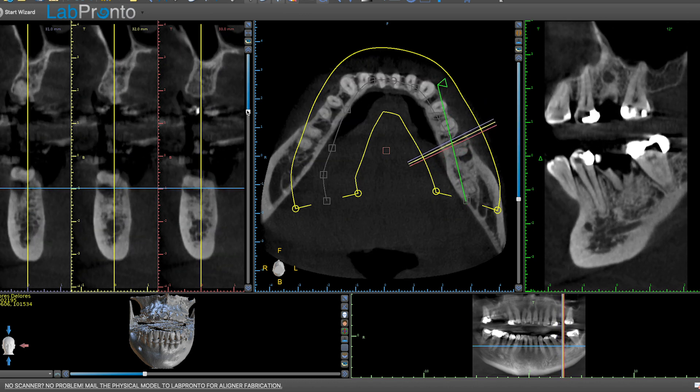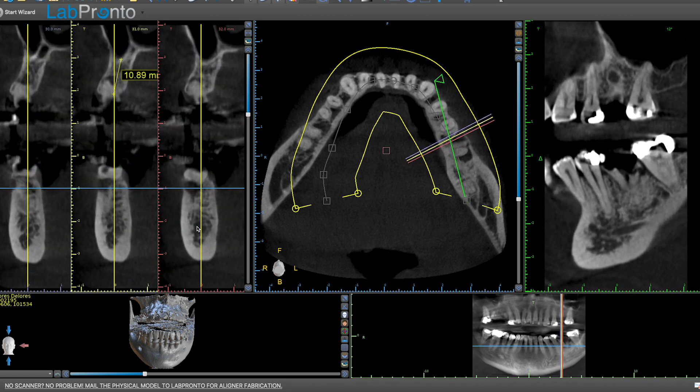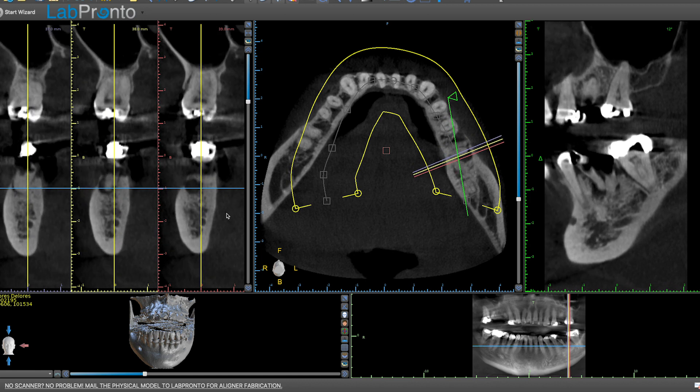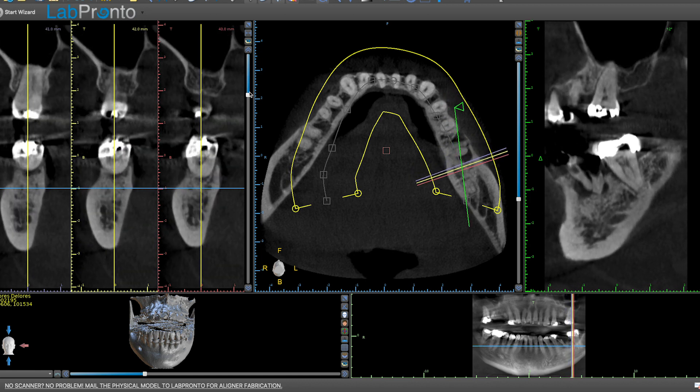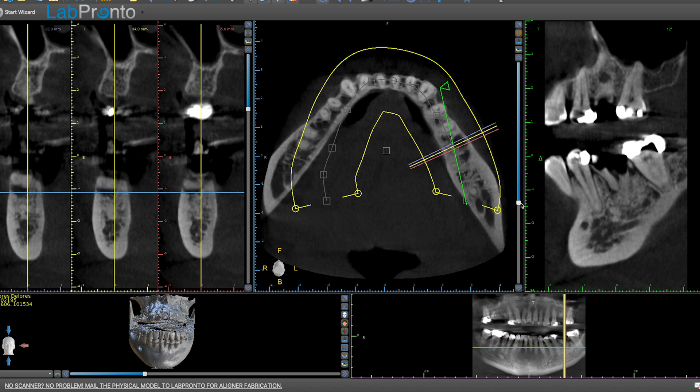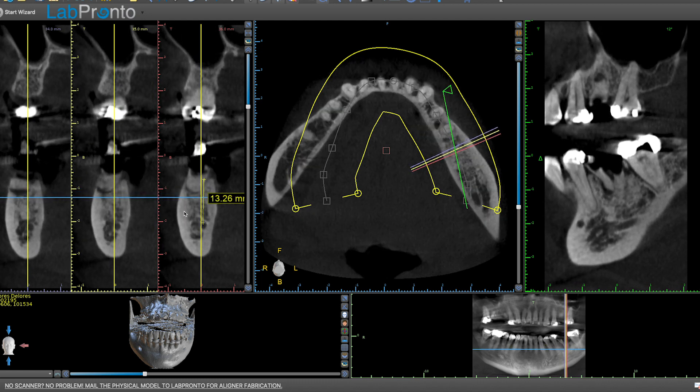Now looking at the lower site in cross section — as I scroll you can see where the nerve goes through, like a little tunnel. That's an easy way to get your reference for measuring. From the nerve to the crest of the ridge it's 13 millimeters. You want to stay at least two millimeters away, so I'd place a 10 millimeter implant. This site is actually a better candidate for immediate placement — there's plenty of bone after the apex of the root, plenty of width bucco-lingually, and a lot of space before the nerve.